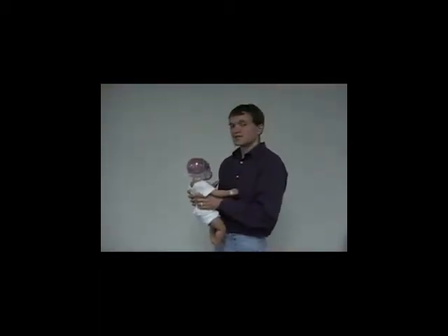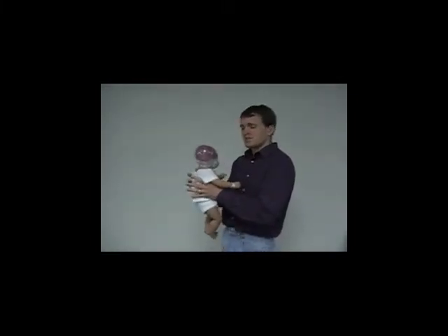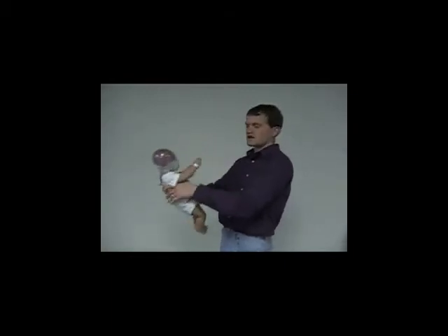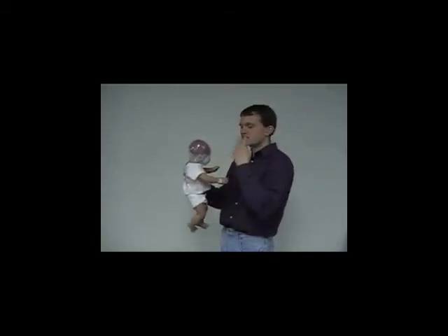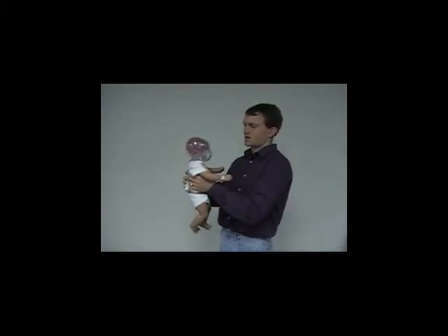When demonstrating the Shaken Baby Simulator, it all comes down to technique. When demonstrating the baby, do not give it long, sharp motions or single shakes. The baby needs to have some continuous movement throughout in short motions, and I will demonstrate.